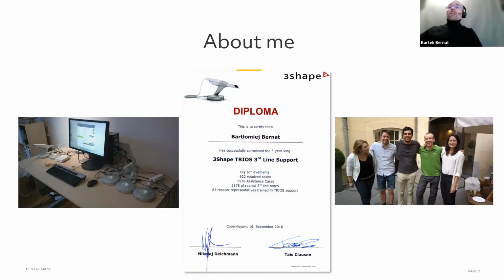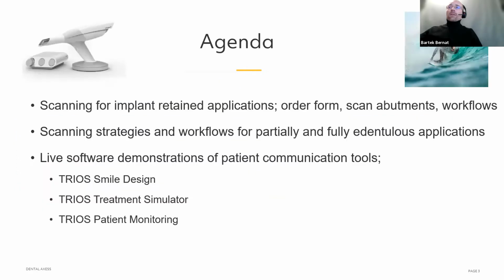So basically, let's go to the agenda for today's webinar. I'm going to talk about more complex stuff than before. It's not going to be basic anymore, so we're going to jump straight to the quite difficult part, which is scanning for the implant retain application. I'm going to show you the order form, how to scan for the abutment, and what the workflow looks like. Then we're going to cover some scanning strategies and workflows for partially and fully edentulous applications.